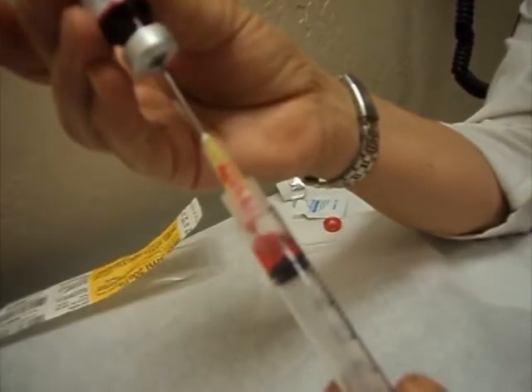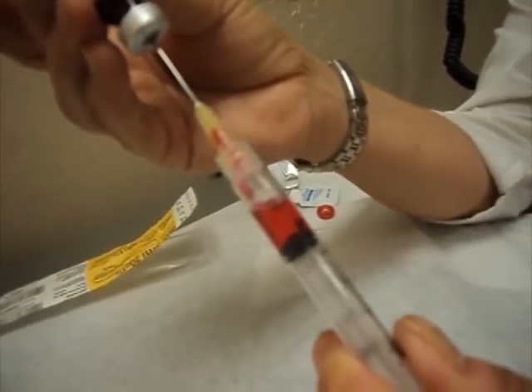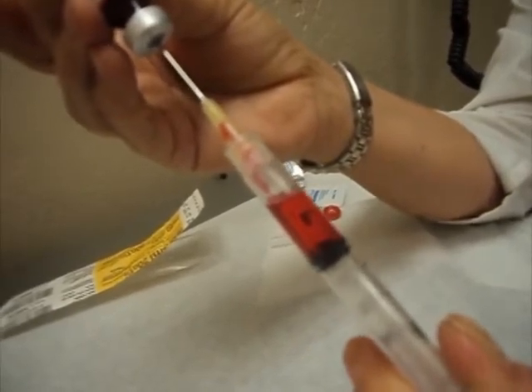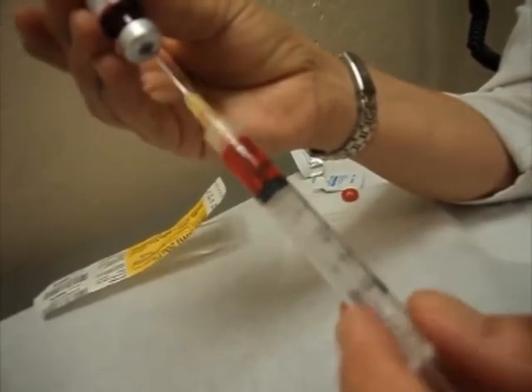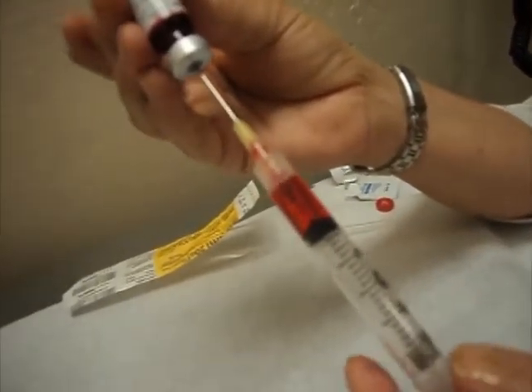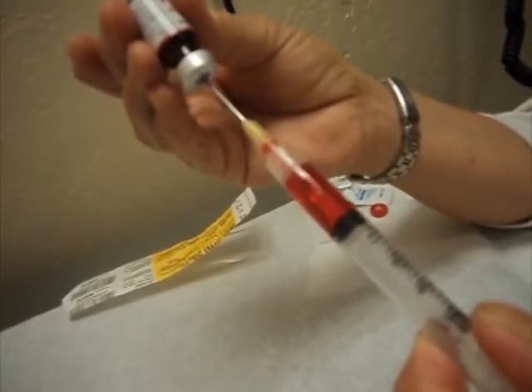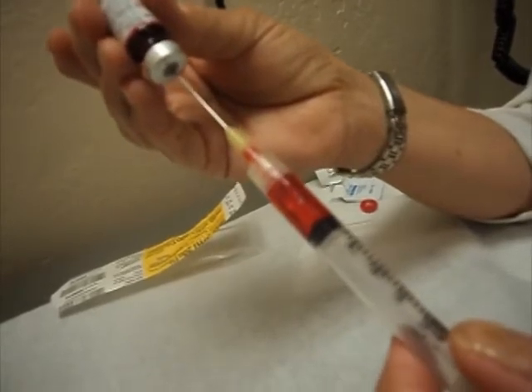You're going to pull back the syringe, and the liquid should flow into the syringe without much resistance. So what I'm doing is filling up the syringe. While you're doing that, you can push the air back to the vial and see that you have the proper amount. So it takes very little to get to the 1. It's also okay to overfill a little bit and then push back what you need.